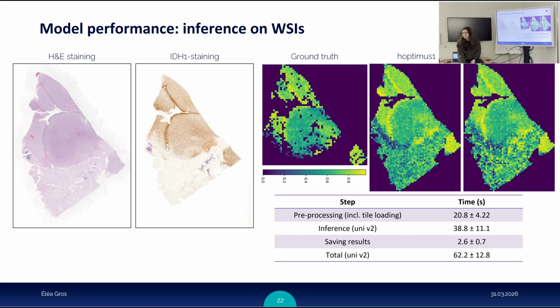And this was the biggest challenge once we were setting these classifications, also in the frame of the Éléa group. I mean, sure, if you have less than 10%, the brain tissue morphologically looks almost normal. If you're in the tumor center, you have more than 70% of tumor cell content, it's also very clear. But what happens in between? This was always the burning question for us. You're between 10 to 20 until 70. In the beginning, we had low-level infiltration and high-level infiltration, but to find the gradient was really difficult. And then we just put one infiltration class for high and low level.